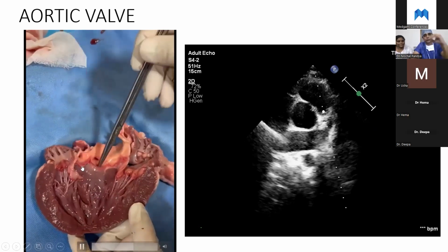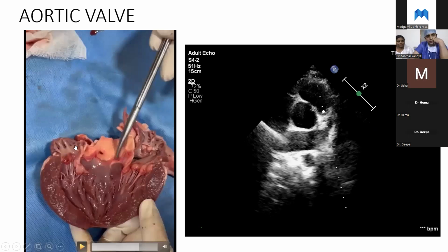So when we look at the aorta closed, this would be your left main coronary artery. That's the right coronary artery. So the LCC, the RCC, and the non-coronary cusp over there. Typically, this AML would lie anywhere from half of that left coronary cusp up to the non-coronary cusp, half of it. The RCC is free, it is anterior.